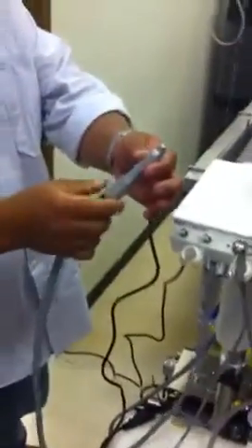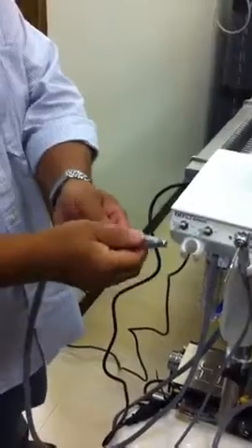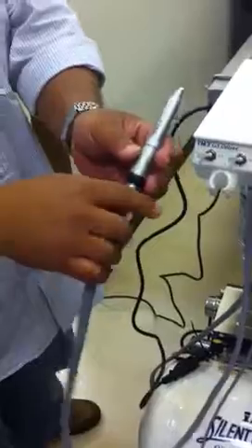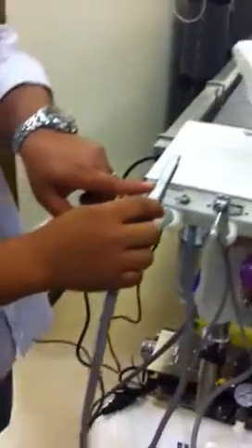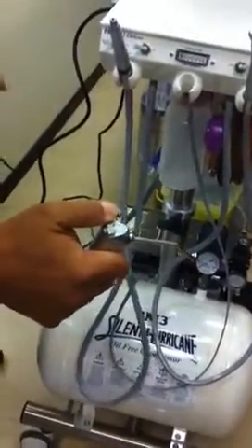iM3 comes with a 4:1 straight nose cone, because these handpieces revolve at 50,000 RPM, so this converts down to a quarter of that. Again, this is a three-way syringe. One being the air, one being the water, or you have a cocktail mist.